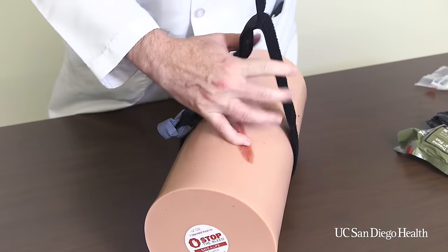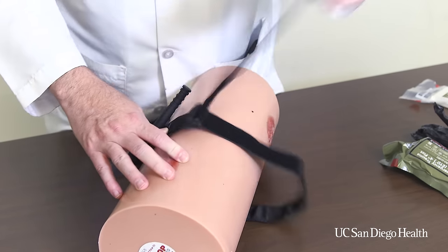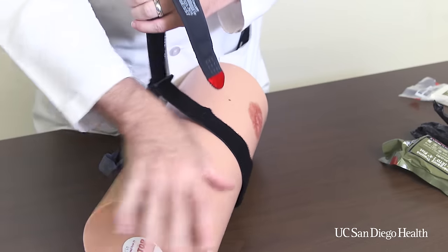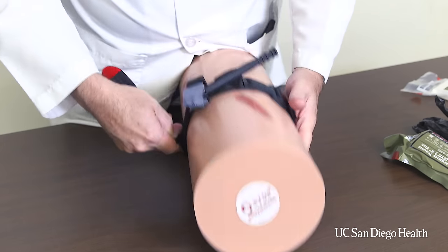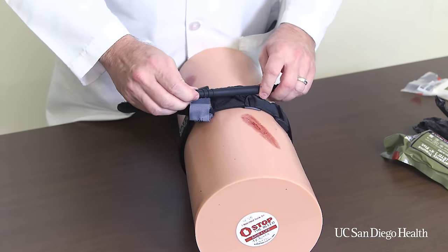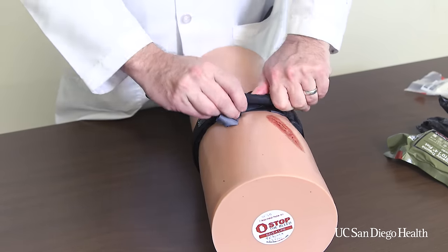Then we pull on the red strap and we snug this down fairly firmly. If you make this tight at this step it gets much easier to apply the tourniquet. We'll put that on nice and tight, bring the strap around up to but not through the clip yet. Then we'll take the windlass rod and begin to twist it — it doesn't matter which way you twist it.